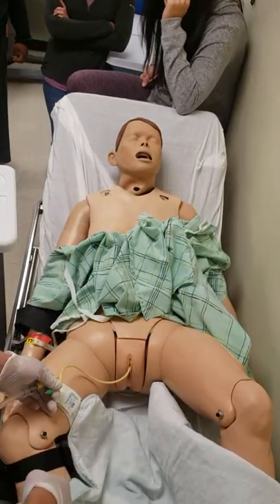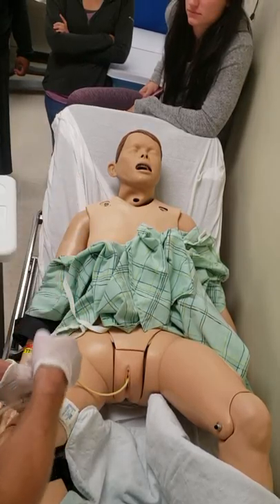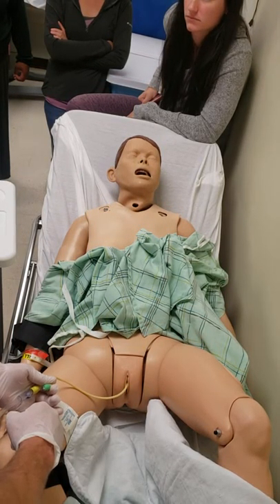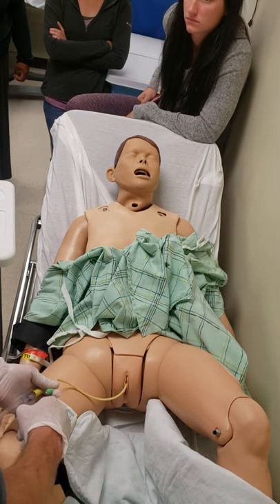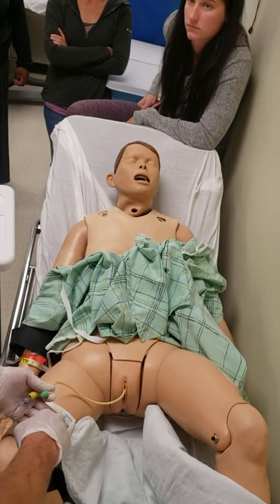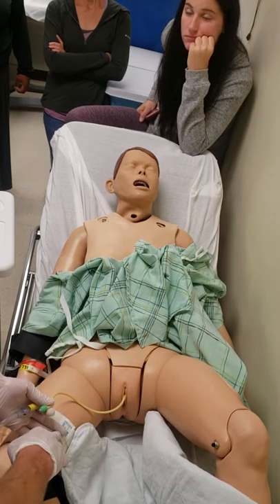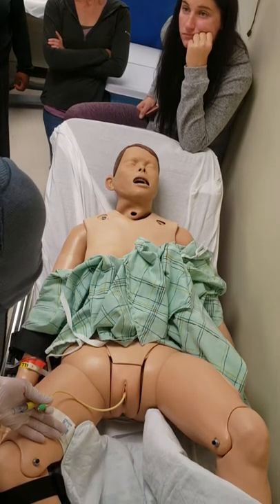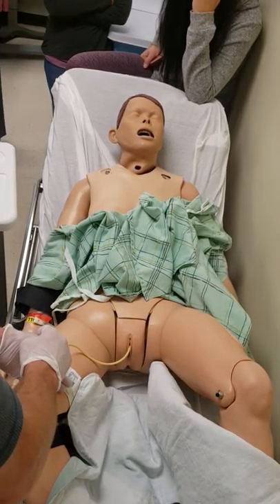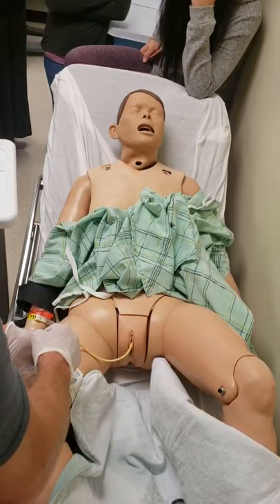You're the patient. Take two deep breaths. On the second forceful exhale, I'm going to pull out. When I go to pull out, you're going to feel some pain — it's going to be more burning in nature than anything. You might feel as though you have to urinate, but you don't, because you just had a catheter in. After I pull out, you have up to eight hours to urinate. If you don't urinate within eight hours, I may have to bladder scan you and put another catheter in. To encourage you to urinate, here's a big cup of water — start drinking right away.